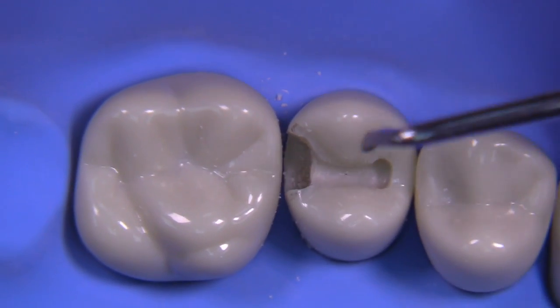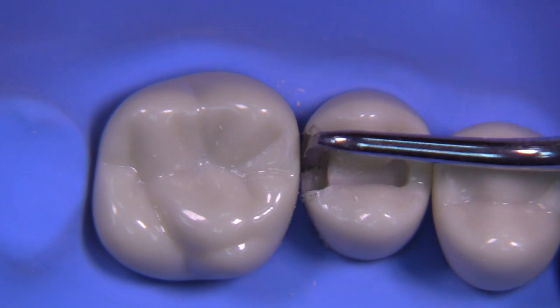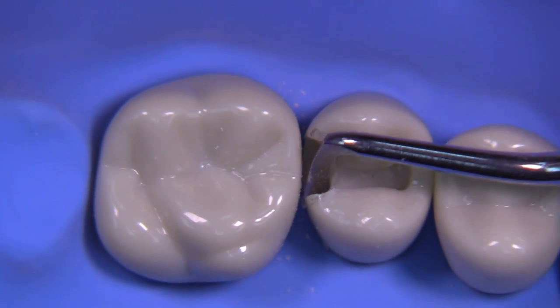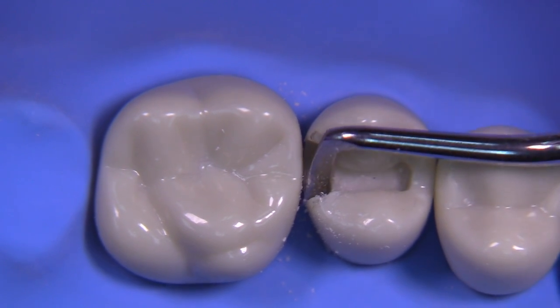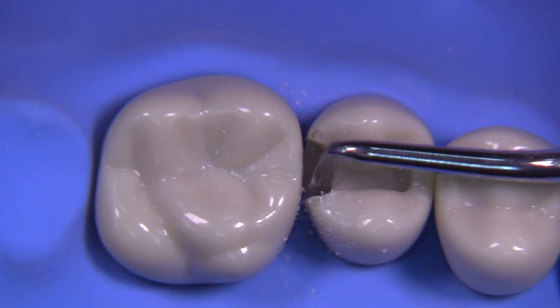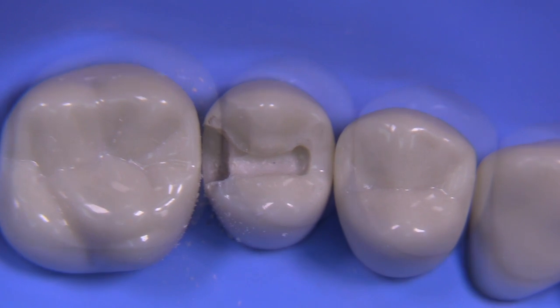The gingival wall is flat and now we're ready to move on to the gingival margin trimmer to initiate the axial-pulpal bevel. Start in the middle and rotate the instrument towards the lingual, then turn the instrument around, start in the middle, and rotate towards the other side — you see how it just peels off that little piece. Don't scrape it and overdo this particular step; just do it very carefully with minimal movements of the hand instrument. Now I'm just removing any loose enamel rods out the gingival, and then turning the instrument around and rotating it towards the other side. This will also increase your gingival clearance slightly.